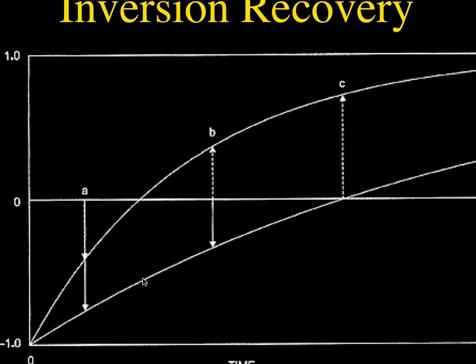The time between the 180-degree pulse and where we initiate the 90-degree pulse or initiate the spin echo sequence is called the TI, or inversion time. If it's short, we can nullify fat, and water gives us a bright signal, and what's that called, Michael? That's a STIR sequence?